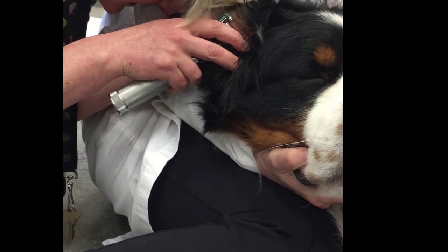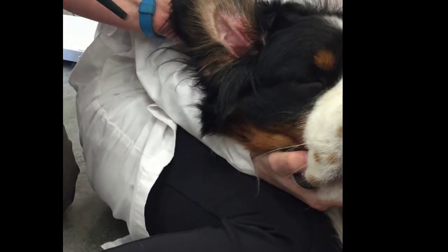Good. So I can see all the way to the eardrum. There's not too much debris in the ear, even though it's sore. So now I'm going to demonstrate how to get a sample for ear cytology.